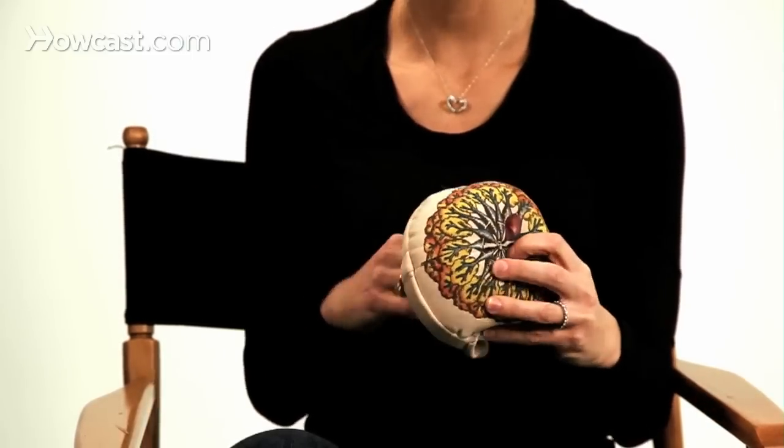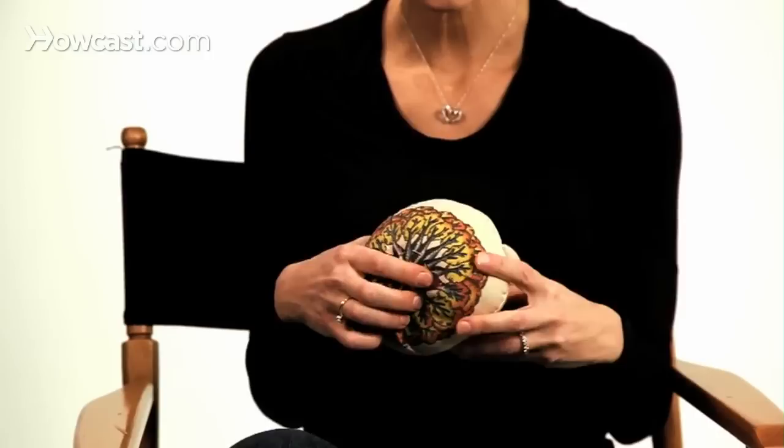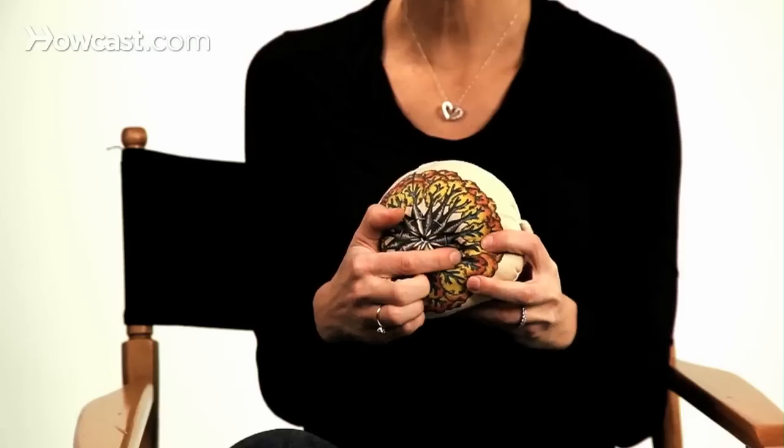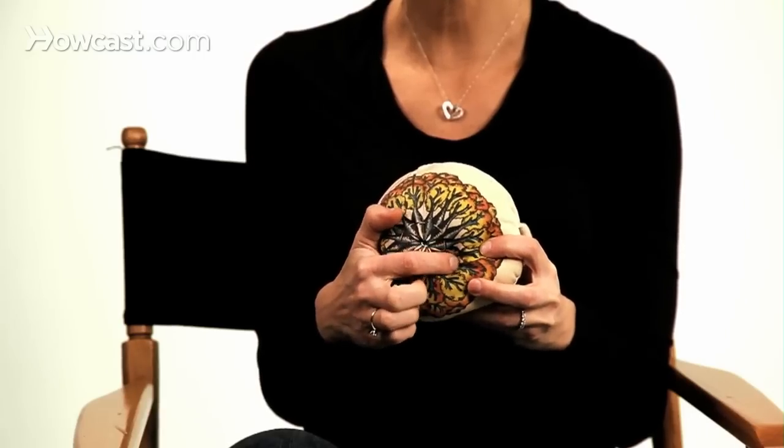With a plugged duct it's going to be very similar, although you will usually find with a plugged duct that you will feel a little ball, a little hard knot in the breast — you'll feel the plug. I always recommend massaging just that area at the same time that you're pumping in order to clear the clog. That will really help.